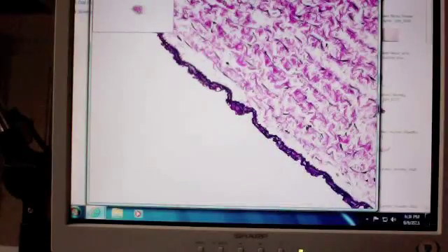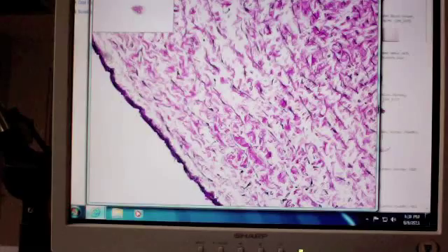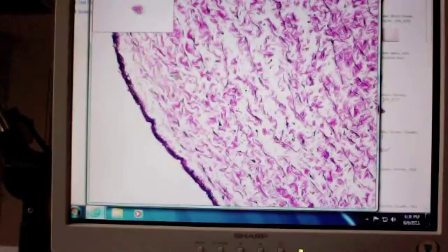have been part of the mesothelium. Now, because it's the umbilicus, this is also going to have associated with it, depending how close you are to the embryo or to the placenta, a syncytium. So looking at the shape of these cells, this is probably part of a syncytium, but technically it's a mesothelium because it's on the outside of this organ.